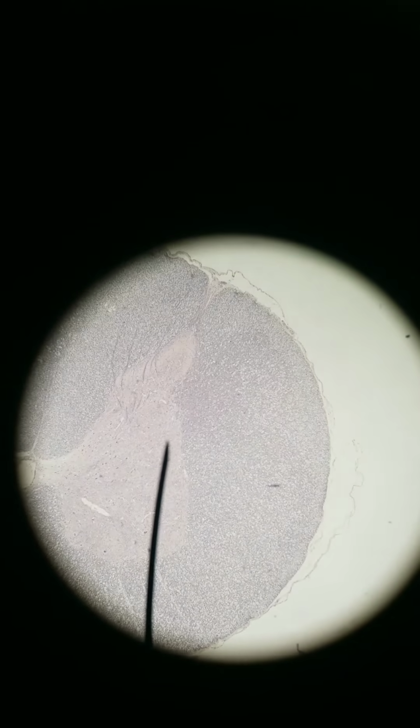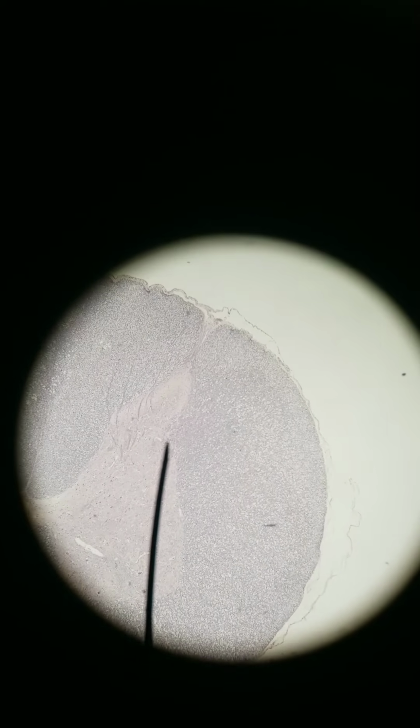That's the central canal. It's lined by ependymal cells. We see this butterfly shape. I know it appears lighter with the stain. It appears lighter because, you know what, it shouldn't appear lighter. I don't know why it appears so light.